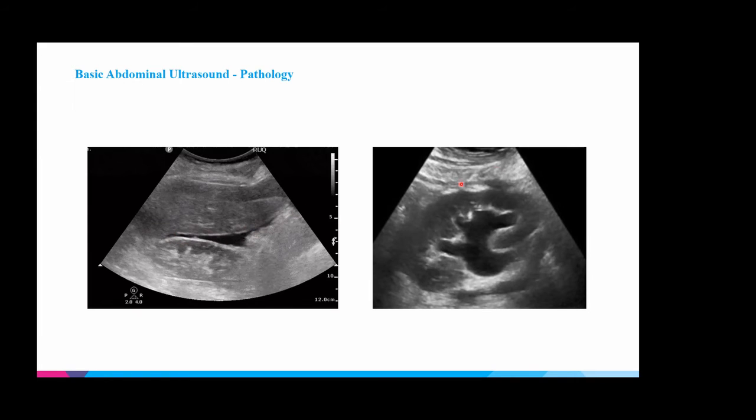Okay, and then this. So what am I showing here? Hydronephrosis. Exactly. So in the center you're getting an obliteration of your normal structures, and you just have some anechoic black fluid collection, right? This is an example of moderate hydronephrosis. I classically look at moderate hydronephrosis as someone sticking a baseball mitt or even a hand in the center of the kidney.